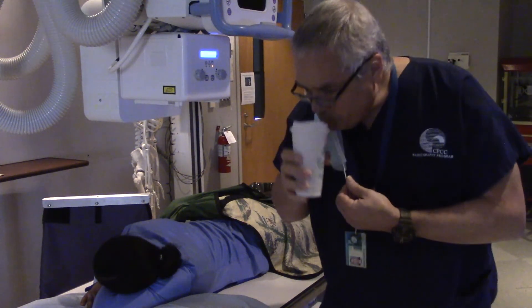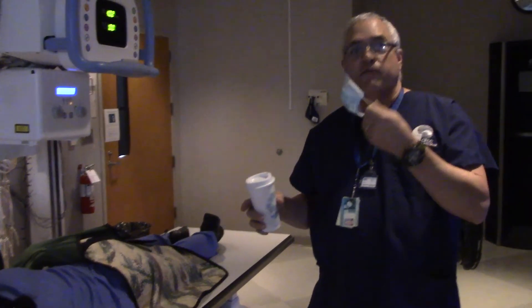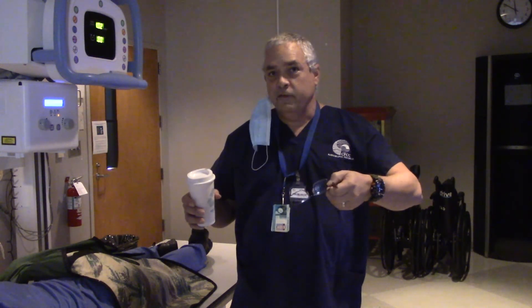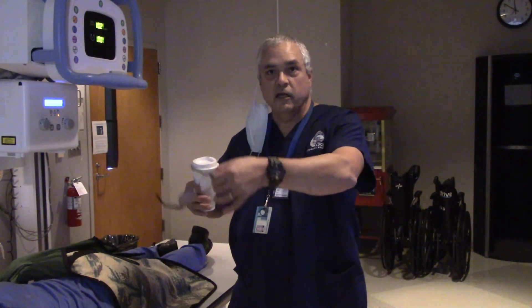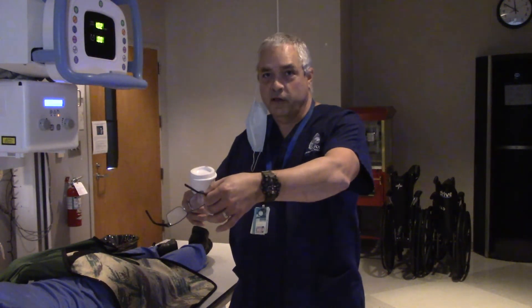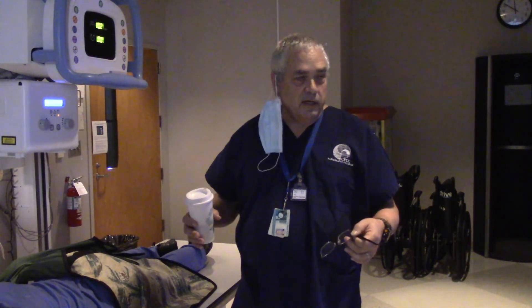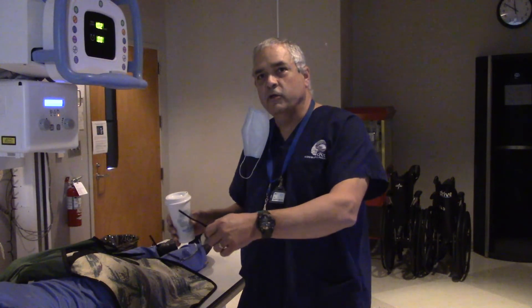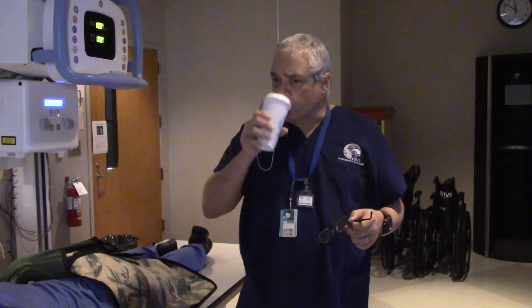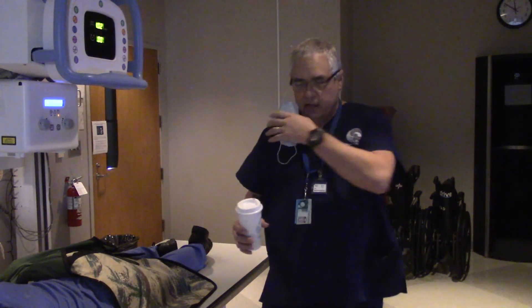All this x-ray and thirsty work. So there we go — those are the three main positions that we use for an esophagram. Typically this is going to be done after a fluoroscopy procedure where the doctor's already got some spot films and they just want these for some follow-up images. The idea is to show the entire esophagus with contrast in it, all the way from the throat down to the cardiac sphincter at the stomach. And if you demonstrate that, then you're good to go. Now what if we take this image and we're off-center one way or another? We're going to have to repeat it — sorry, you're going to have to drink again. So figure out where the esophagus is and determine if you need to be more left or more right. Hopefully you're going to get it right the first time. All right, now it's y'all's turn to give it a try.